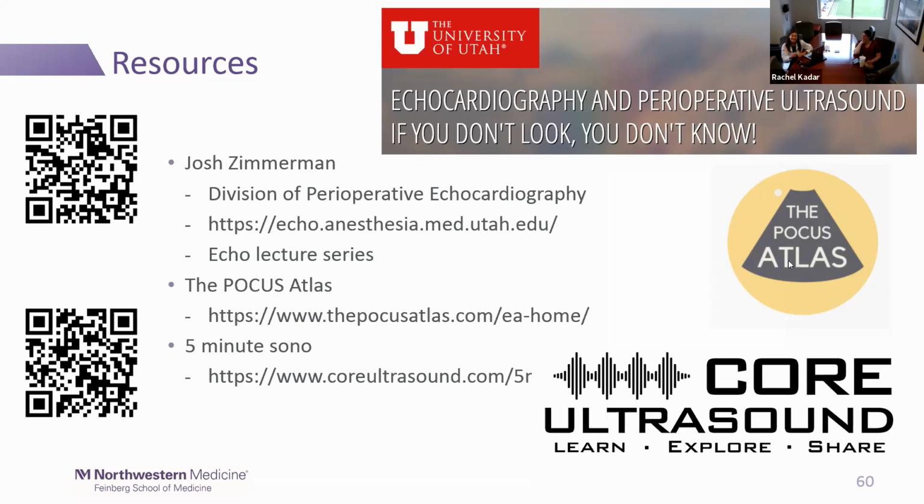So one question I have: when you show some of your images and obtaining those images, the patient has to be in a specific position. Many times in the OR, we don't have that luxury. When something like this is occurring during a case, you can't turn the patient lateral to obtain that optimal image.